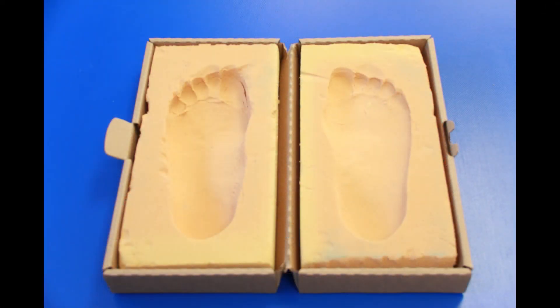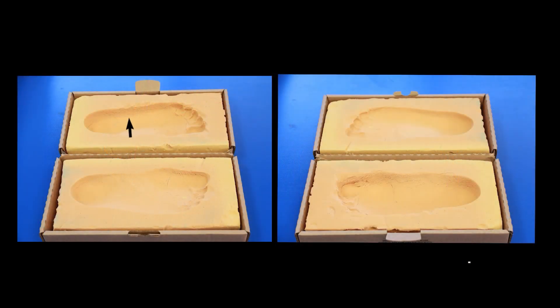This example shows an accurate impression of the left foot, but the right foot is too shallow and unusable to create an orthotic. From the side, you can see good depth in the borders of the left impression, but the right impression is too shallow.